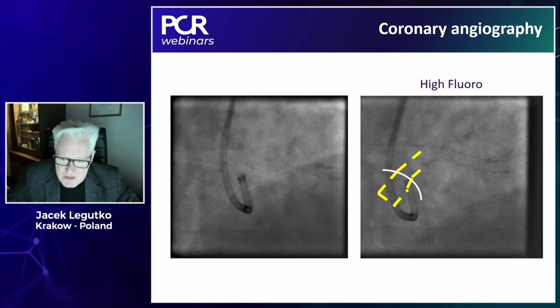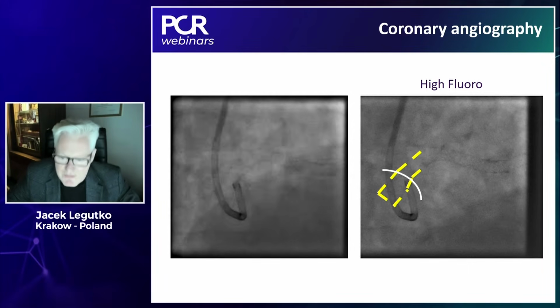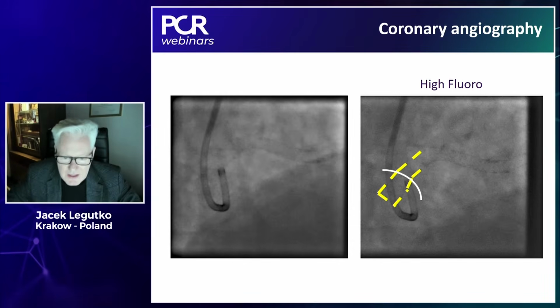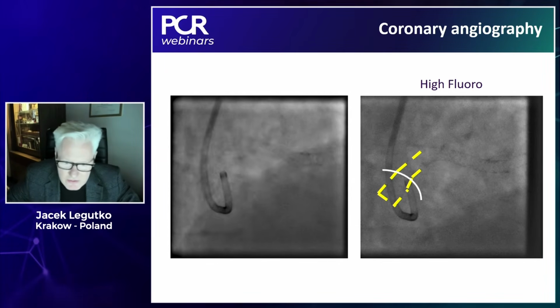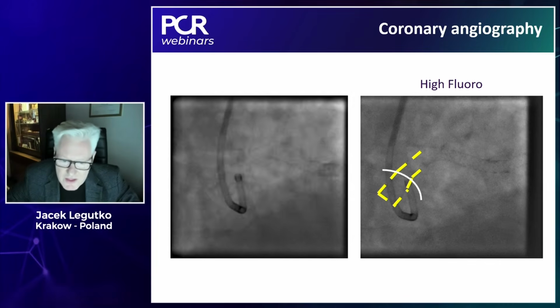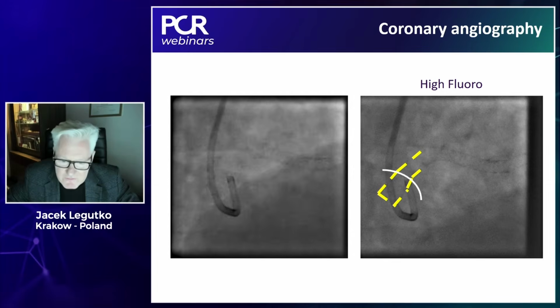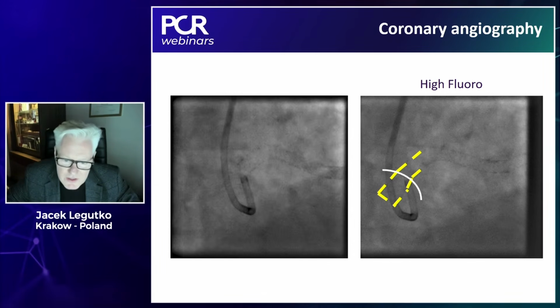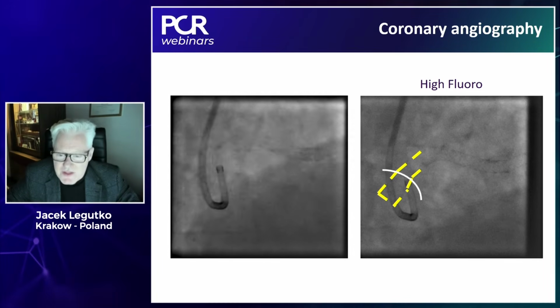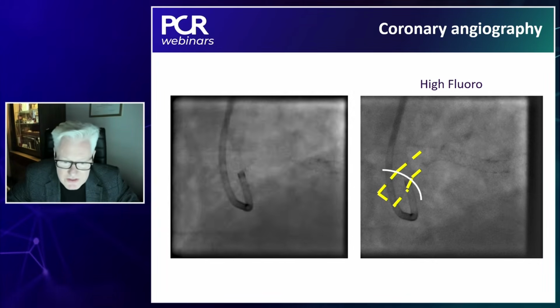So we have a patient who is not a good candidate for surgery, with acute coronary syndrome after previous left main PCI, with some suspicion of restenosis or some edge or stent failure related to the problem in the ostium of the left main, and we have difficulty engaging the guiding into the stent. So at this point, maybe we can discuss, or of course, if you wish, I can continue with what I did.